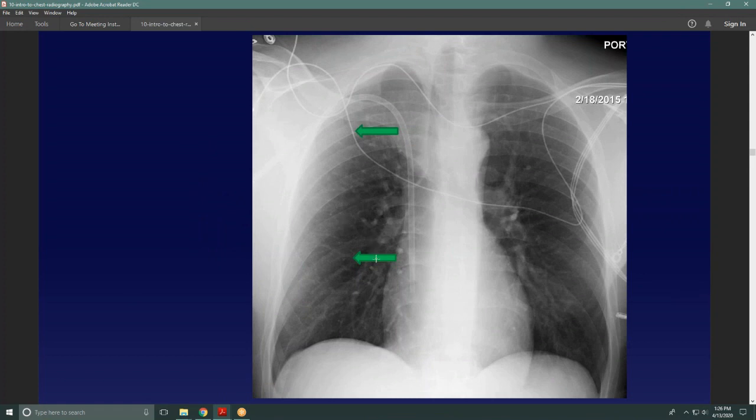Wow, those arrows completely moved. I don't know what happened. I was having some problems with PowerPoint not working on this computer very well, so I transitioned this to a PDF. Things got a little bit garbled when I did the transition to PDF a few minutes before this talk, so I apologize. This is the catheter here. This is what it's supposed to be pointing at.